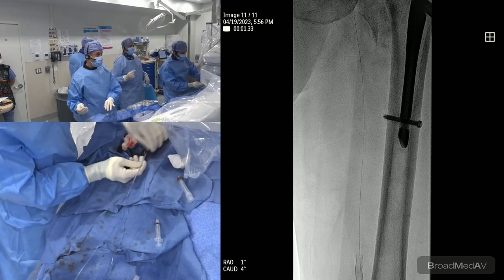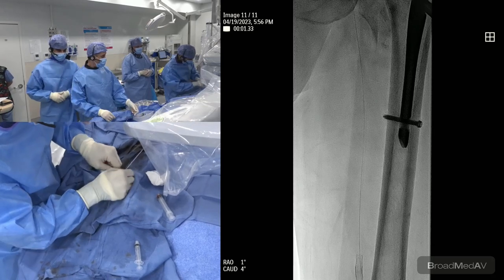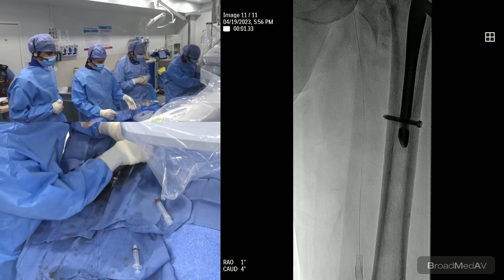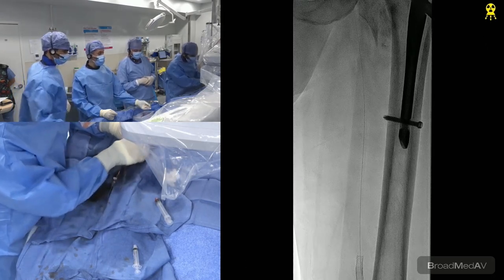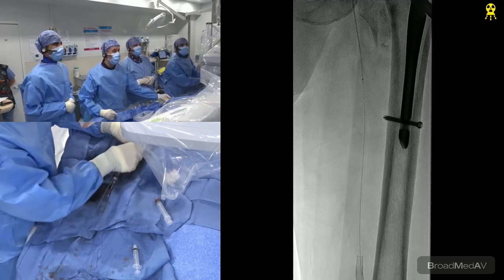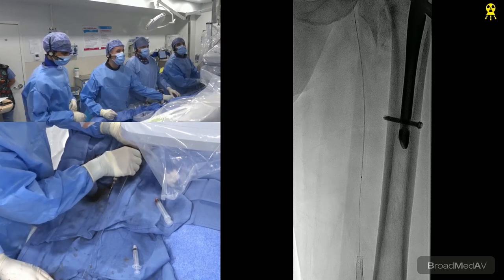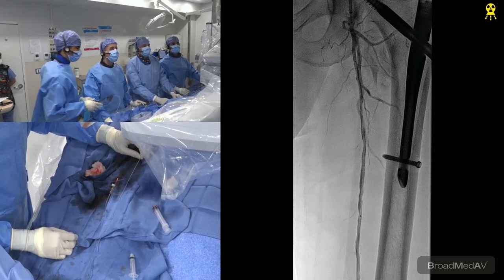So can you show where we're going to go? Okay, from that screw up. Now we do the peel away. We got 5 minutes. We can get this done in 5 minutes. I got it, brother. Good. Perfect. Yeah, a little bit further. Yep. 5.0 150.